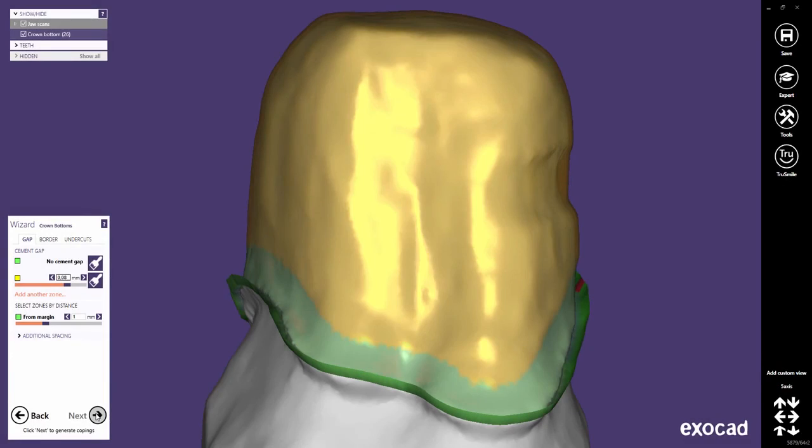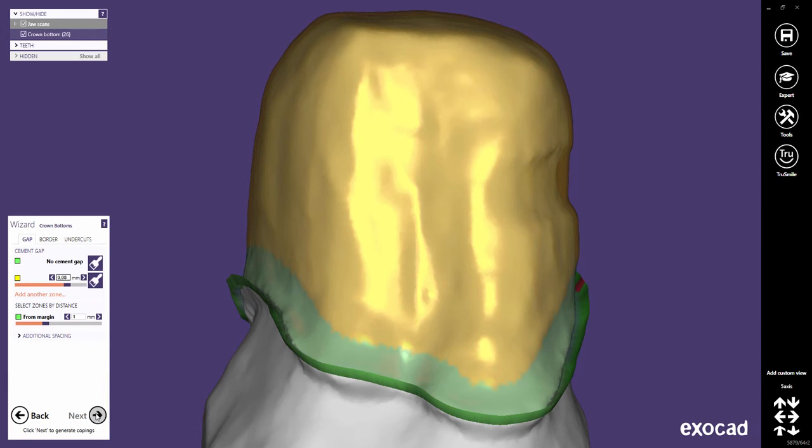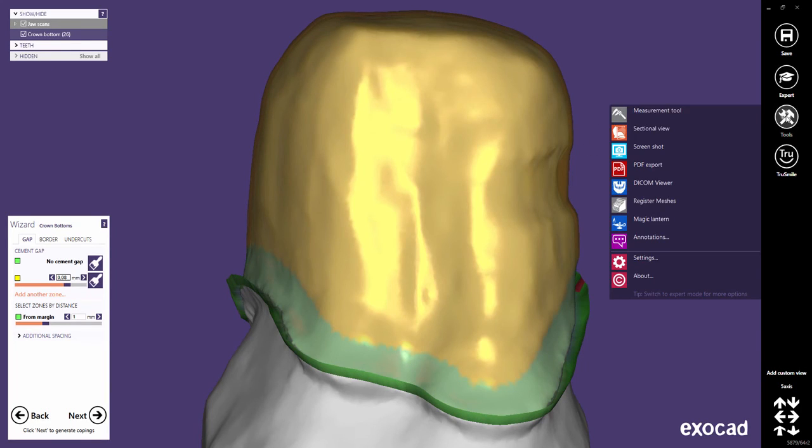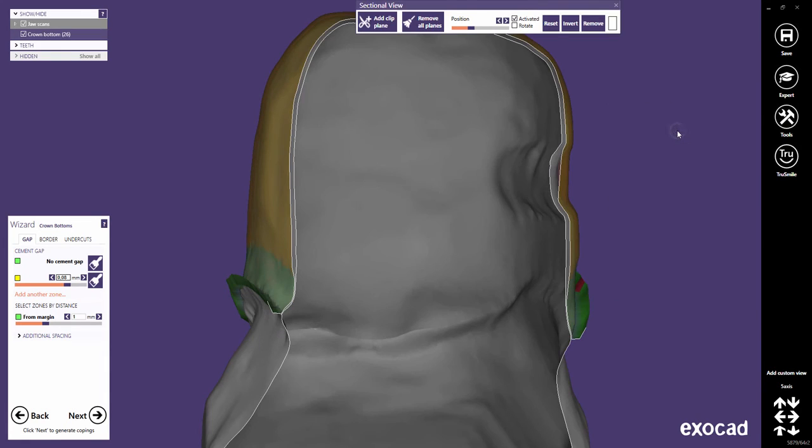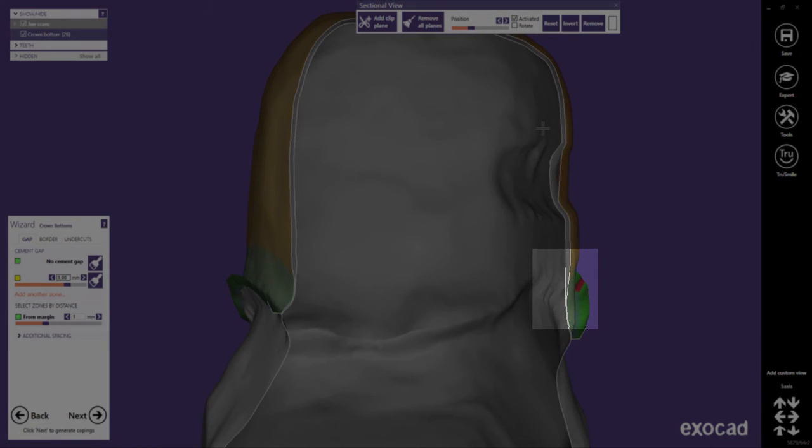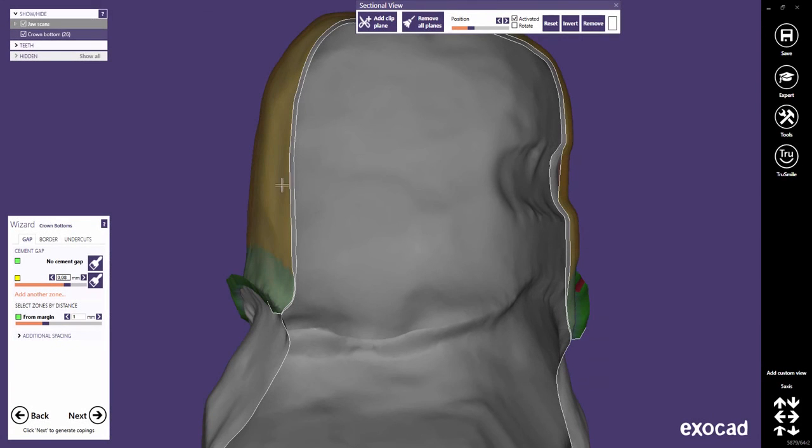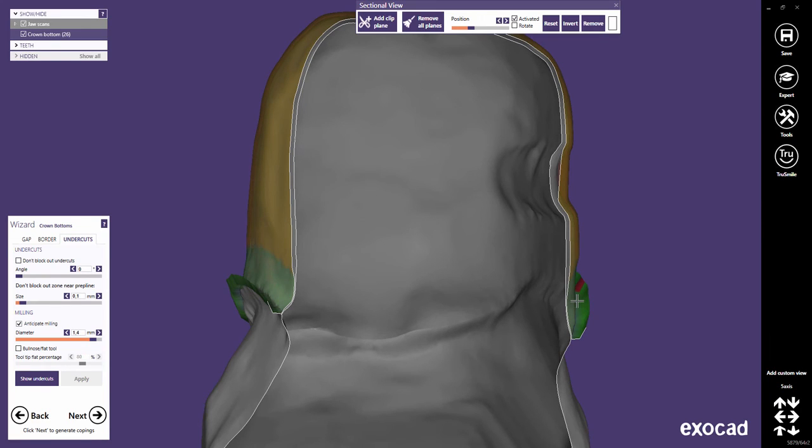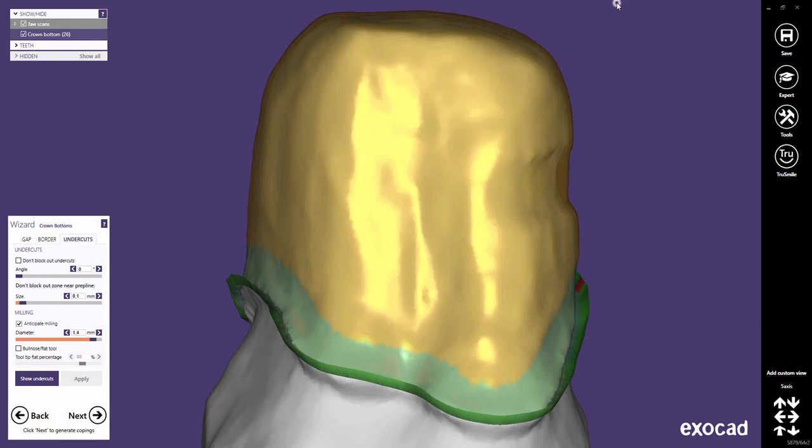The software's exact blockout behavior depends on the material configuration provided by your system integrator. In most material configurations for 5-axis milling, the cement gap is applied after doing the blockout. This means that for step preparations, generating the cement gap itself may cause new undercuts. In 5-axis configuration, very often a defined zone near the margin line is not blocked out. This also could cause new undercuts in the margin area. But that is fine. A 5-axis machine can produce these and it will give an optimal result.